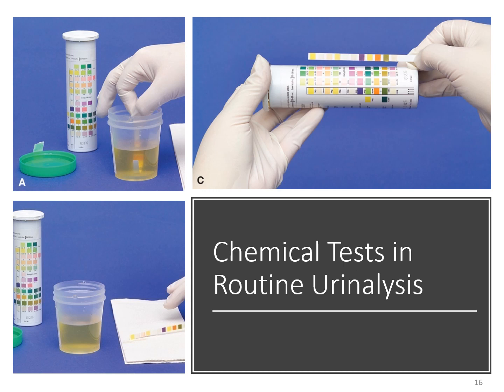Certain manufacturers don't require that you blot it on the side. And so you would just pull it out and you would rim it across the top of the urine cup and then blot it on its side. And then you are in image C. You're comparing those changes for that reagent strip. For each test pad, you're comparing it to the color chart on your bottle and documenting what color change that you see, which could indicate if something's positive or negative.